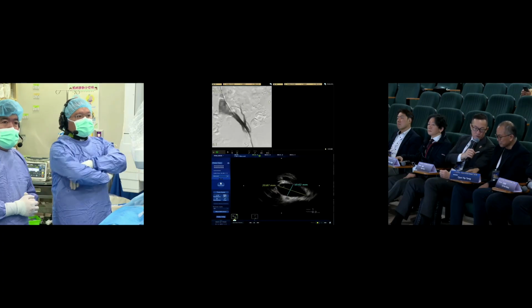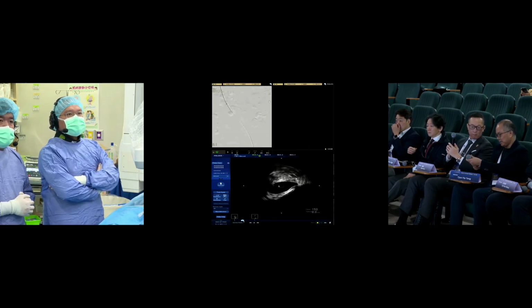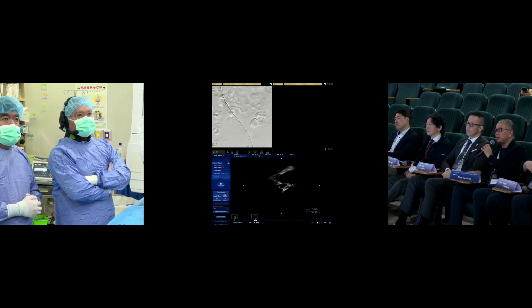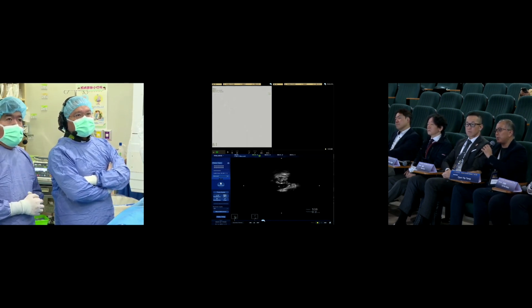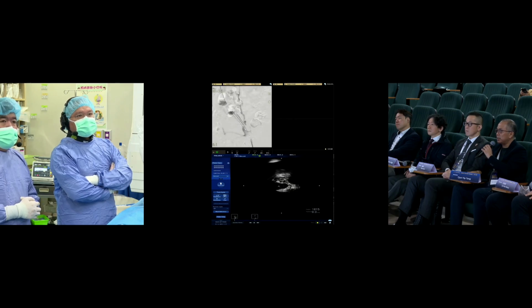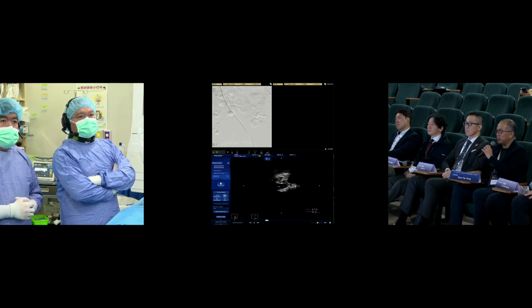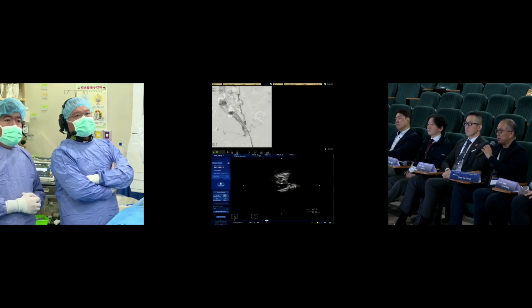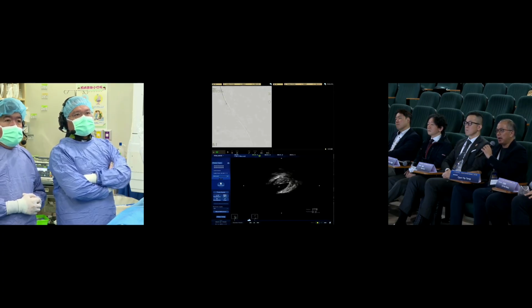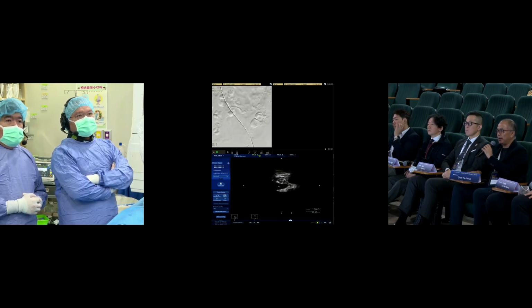How do you think about it, Dr. Tan? Thanks very much. This is a very interesting case because I know the patient had a previous deep vein thrombosis as well. And if you look at the IVUS as you go through, there is some evidence of webs or white debris sitting inside the vein. So could that be previous scarring or actually just come from the compression effect? It looks very focal, that lesion. Are there any other compression points lower down on the IVUS? I don't see anything on the other points.